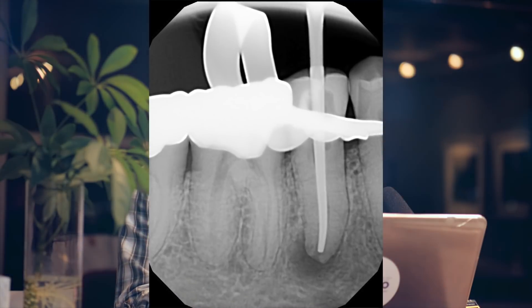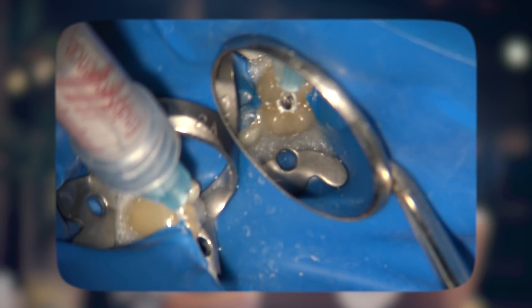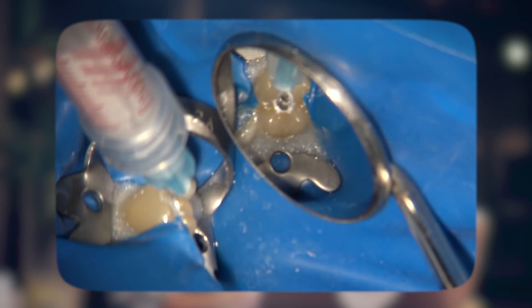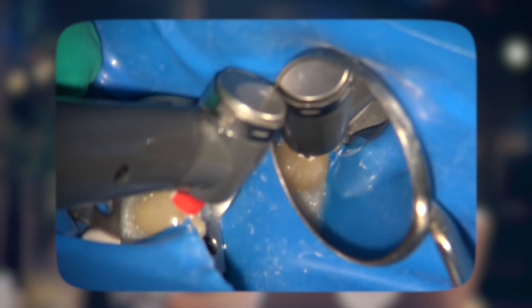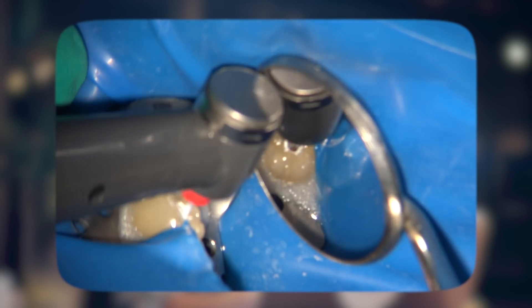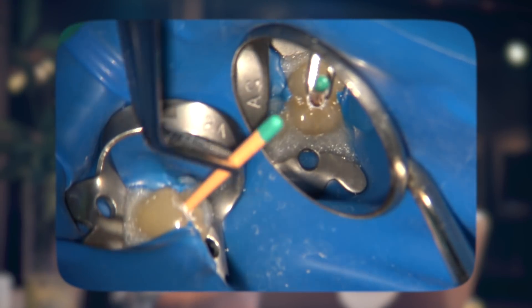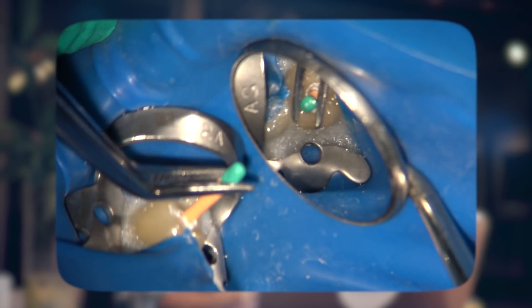In this case, I chose a large size and it turned out to be the exact correct size right off the bat. BC Sealer High Flow was then injected into the coronal section — the coronal half — and then pushed and brought down to the full apex using the XP finisher file at a much lower RPM of about 300 to 500 RPM. The master cone was then slowly seated, allowing hydraulics to flow back the sealer and allow full seating of the cone to the apex.